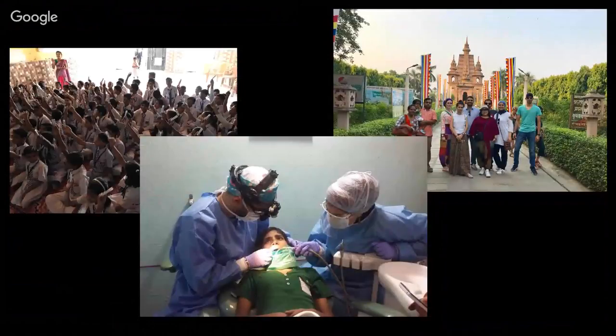This fall I was in India for a voluntary project, and you can see me and my buddies. And here I'm treating this guy. Actually, I remember him. We treated 3 or 4 teeth in one step with rubber dam, because in that way I was faster and more precise.